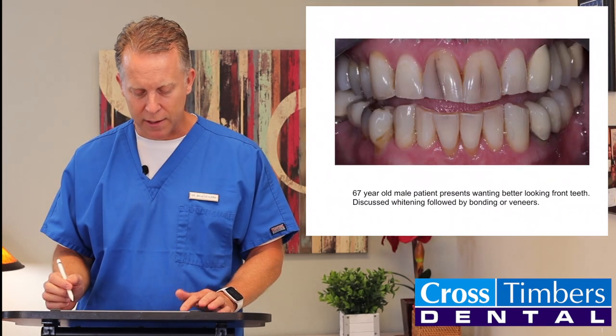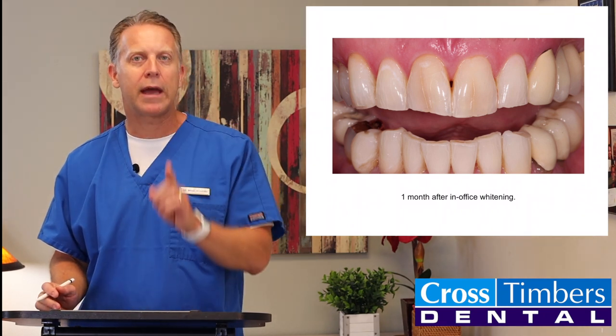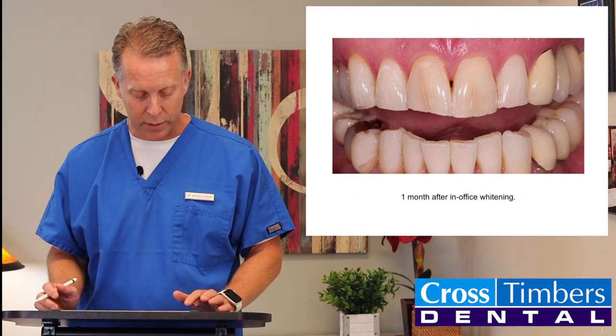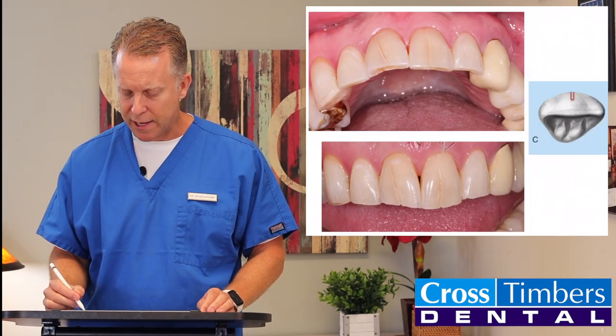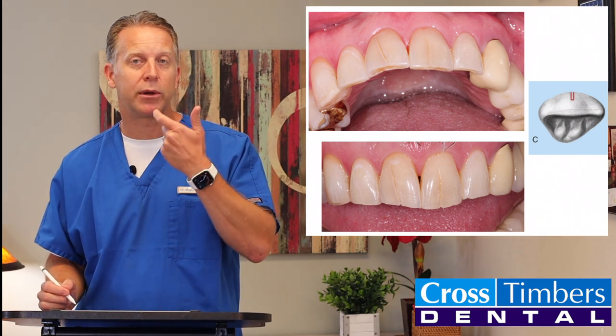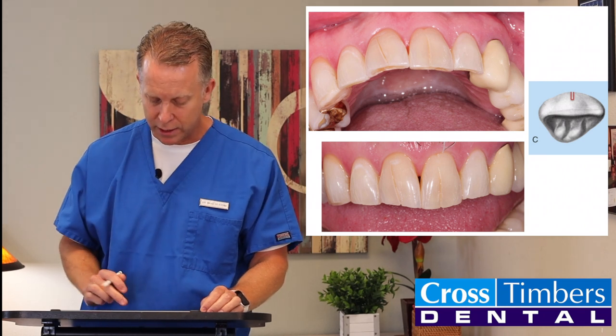Here it is — you can definitely see those dark lines. Then we went in and just cleaned out that groove going up and down those teeth. Looks a lot better already. We made this little slot prep — just cleaning out that groove, that little ditch that was going up and down through his teeth.